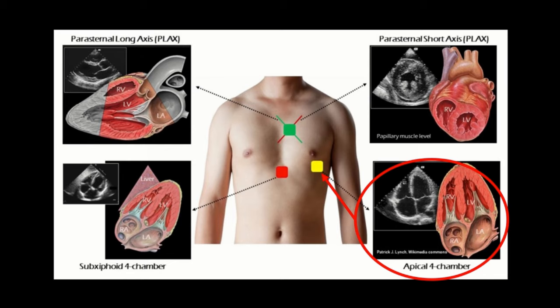In some patients there can be an enlargement of the heart which will shift the cardiac apex to a more lateral and inferior position. If you are not able to get a good apical 4-chamber view near the midclavicular line, try to move the probe more laterally towards the mid-axillary line. Somewhere in between you will get a good apical 4-chamber view.